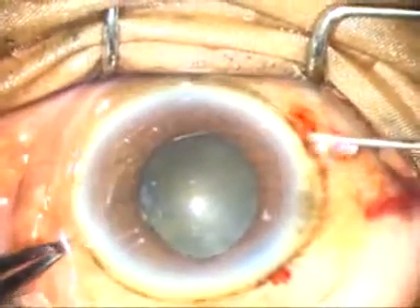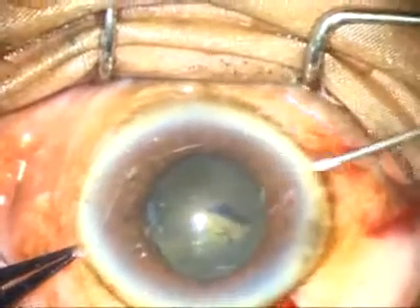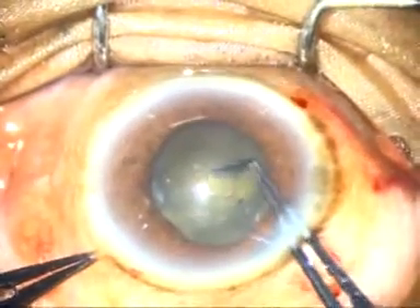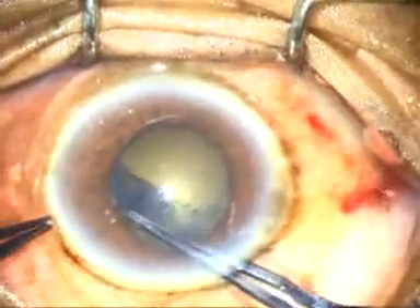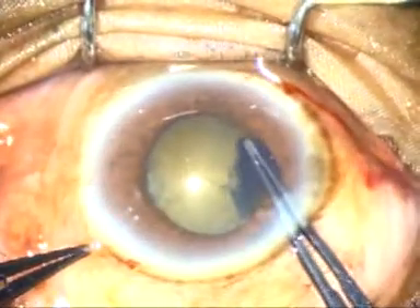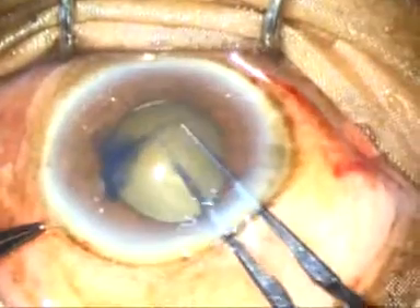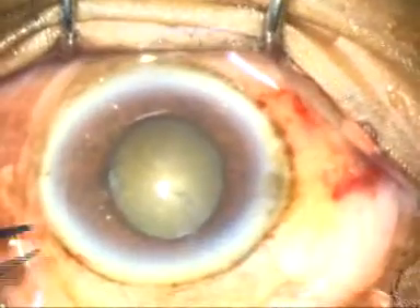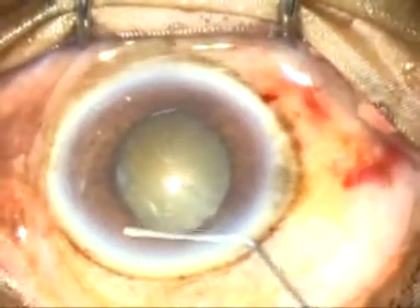I need to do a rhexis which is larger than the size of the pupil. The capsule tag has been raised with a 26-gauge bent needle. I go beyond the margin of the pupil, and with a habitual movement, I can do a rhexis which is slightly larger than the size of the pupil. Now I know that the rhexis has been adequate for this cataract.